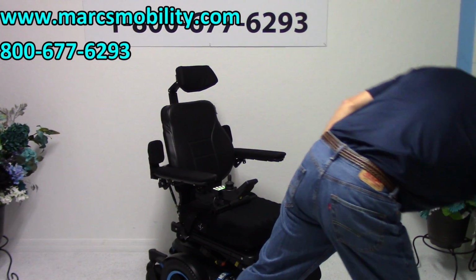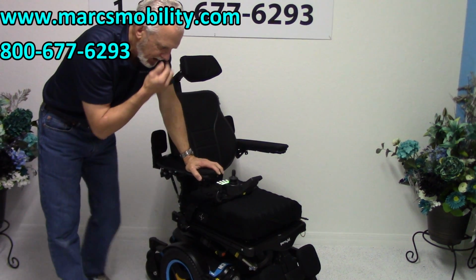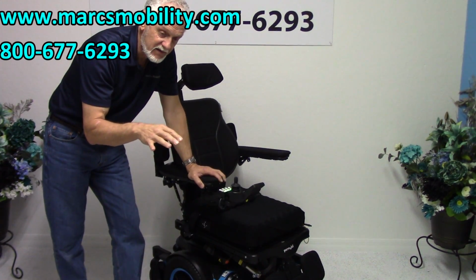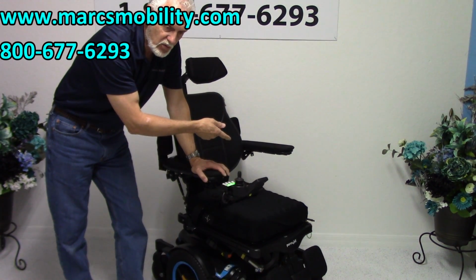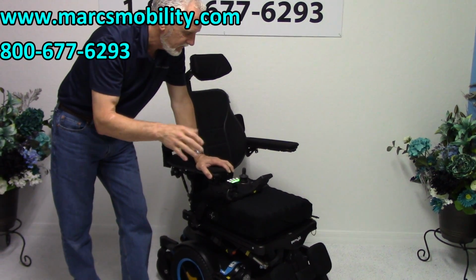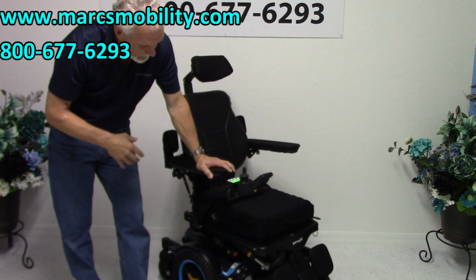There's two batteries in this chair. The batteries come out from the back. They'll give you about 14 to 15 miles of battery charge. But that varies. It depends if you're going uphill through the grass, what the size of the user is, so your mileage will vary. You may get more, you may get less. But you'll get quite a bit with a power chair. You should be able to get all day long in some, okay?